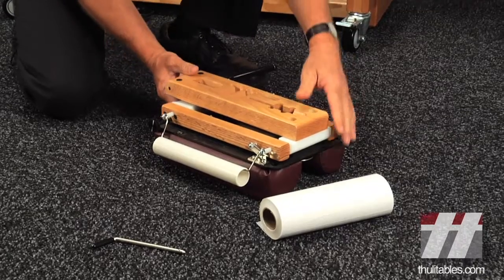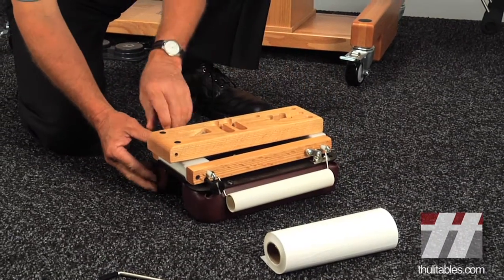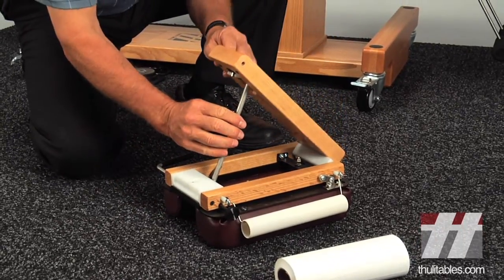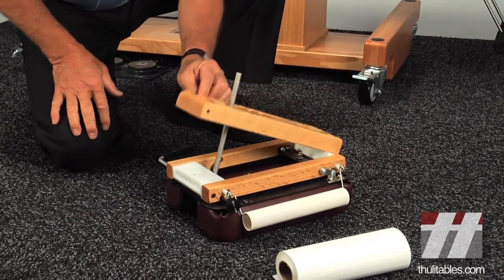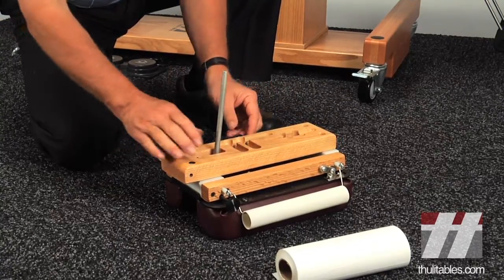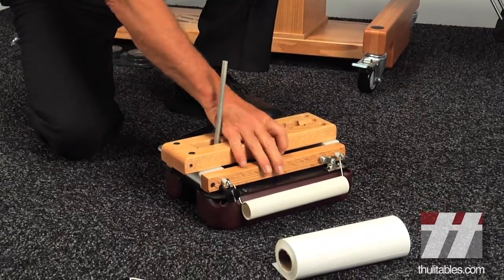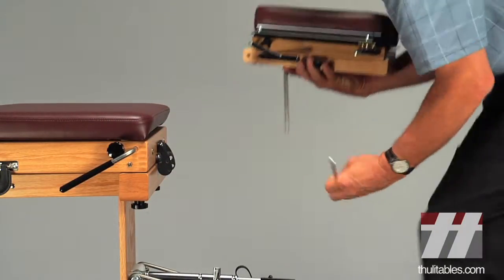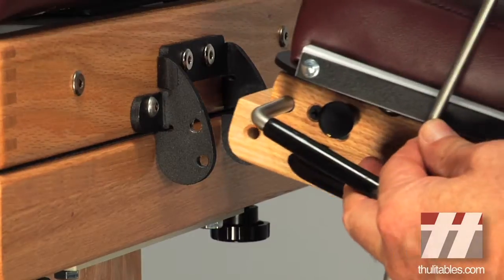Attaching the headpiece is the same as to your portable table. Raise the base block and insert the T-bar into the hole in the locking link. Use counterclockwise pressure on the raising lever to lower the base block. Use the pin that was locking the table closed to connect the headpiece to the table, using the hole appropriate for your accessories.